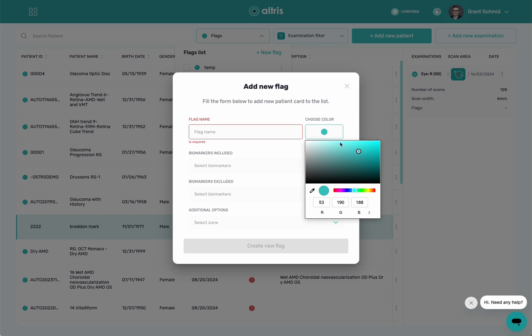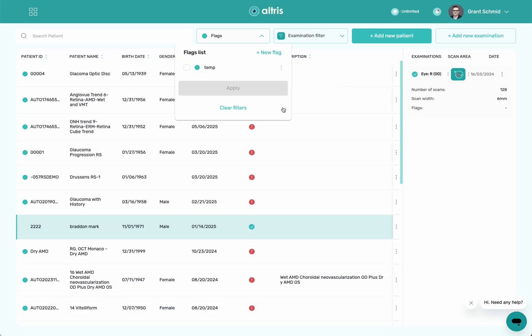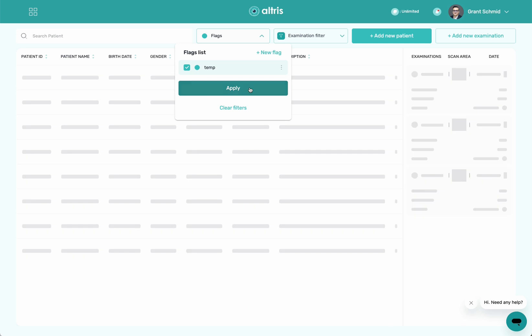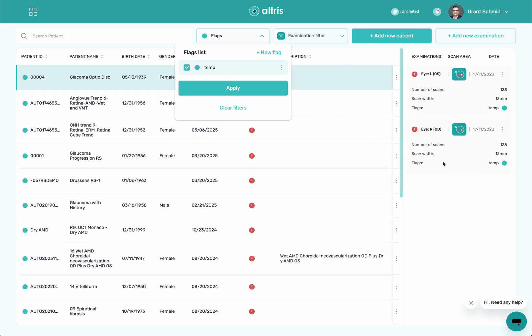This is constantly being updated, so there'll be new features in here soon. You can see I created a flag in here called 'temp.' This is for any patient that has drusen. So when I click on this and hit apply, it's going to search through all the patients and flag patients that have drusen within them. This is great if you're looking for specific data, and it's always working.